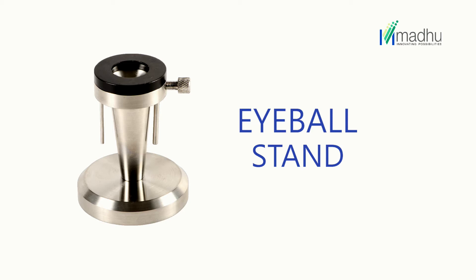An eyeball stand is a mechanical device used for securely fixing the human or animal eyes during a surgical training vet lab.